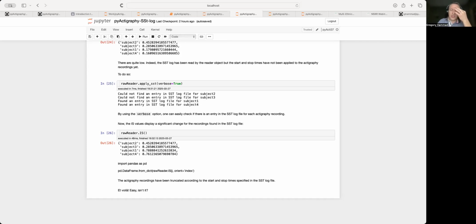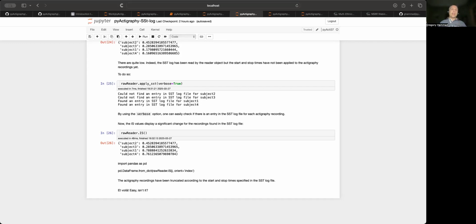It has been recently revised by a group in Zurich that is doing fantastic work in infants. That's the group of Salome Kurth and Sarah Schoch. They publish papers on different ways to also correct and improve this algorithm. So if you look at their work, you will find it, and that's the one that we use. Now that's best in a sense that this one has been validated against the PSG. But as I said, it depends.